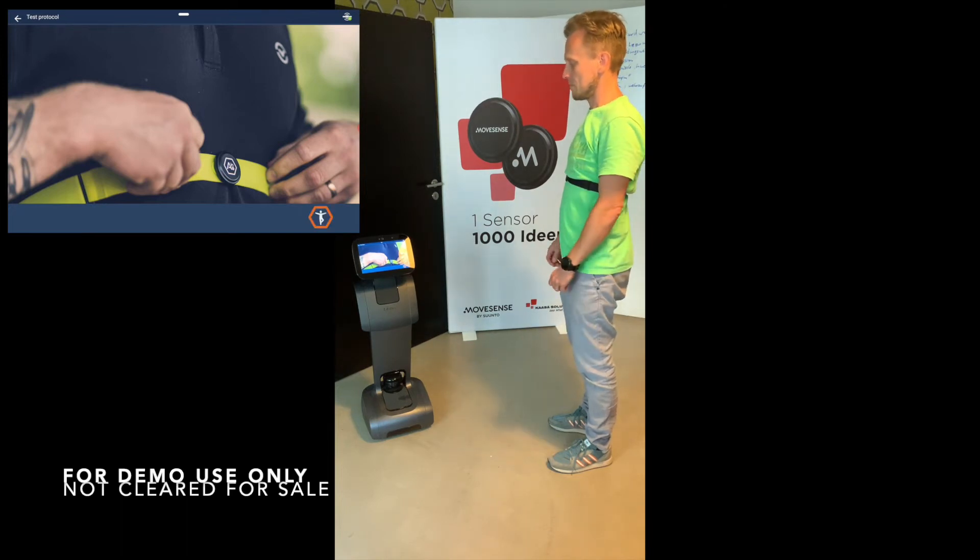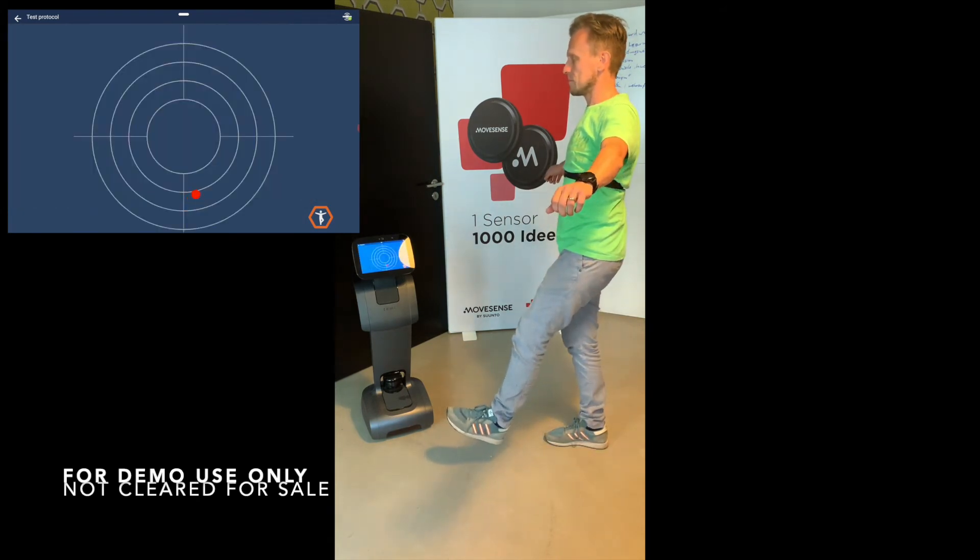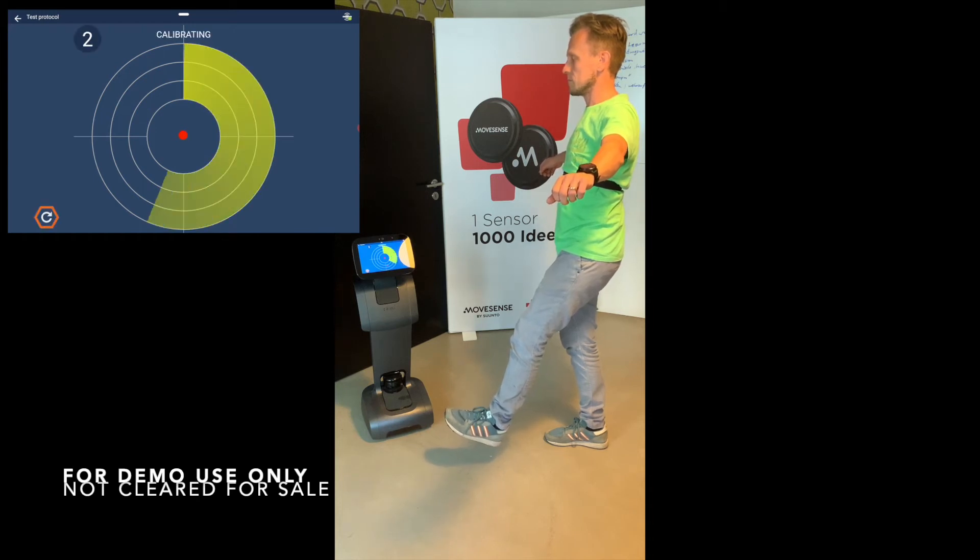Please stand straight, lift your left foot in the air, and keep your eyes open. Preparing measurement. Calibrating. Measuring.